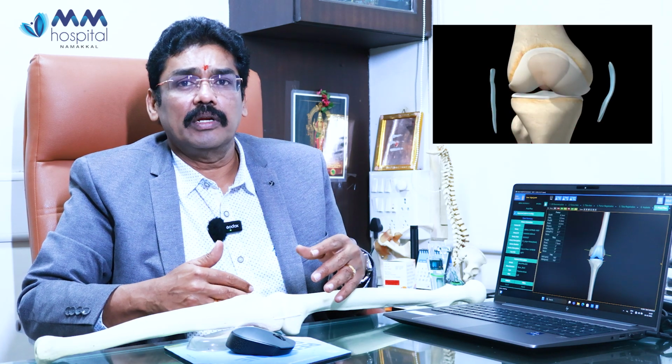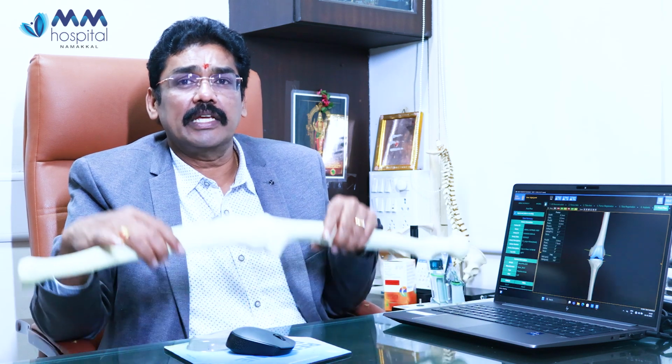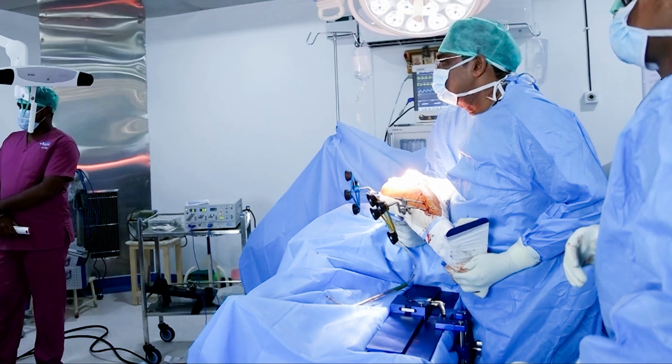What is gap check? It is the soft tissue balance of the knee joint, the medial collateral ligament and the lateral collateral ligament. In a bent knee, the ligaments will be tight. So without touching the ligament, I rotate the implant, I flex the implant, and make sure in the gap check, both in extension and flexion, the soft tissue balance is equal.